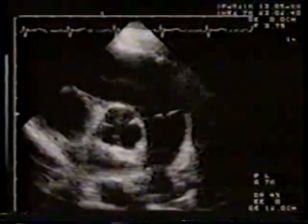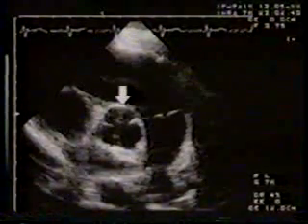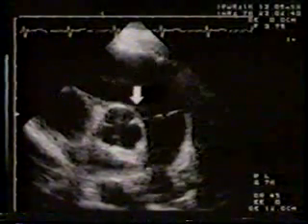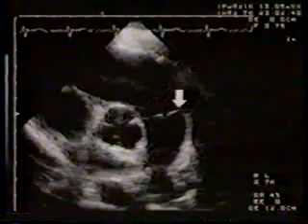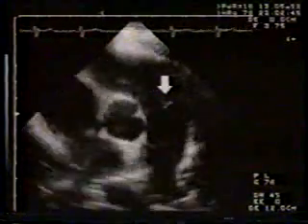This is parasternal short axis view at the base of the heart. This is aortic root, aortic valve. Note that the right ventricular outflow tract is dilated, as well as the pulmonary annulus. In real time, note the normal motion of the pulmonic valve and dilated main pulmonary artery as well.